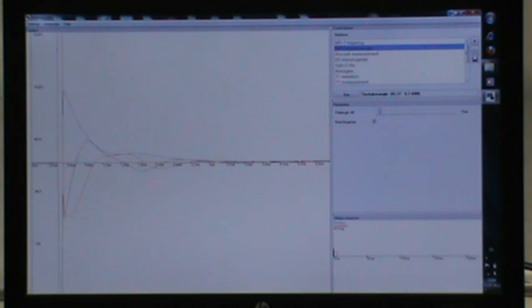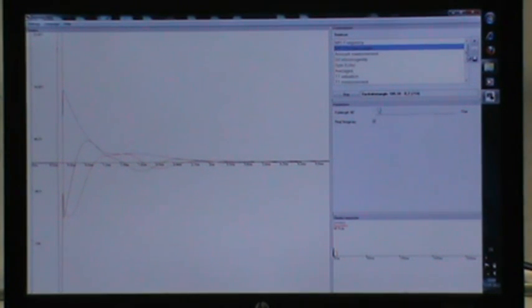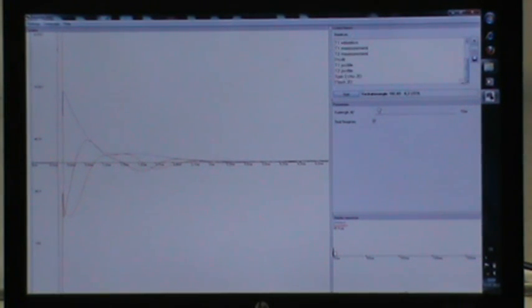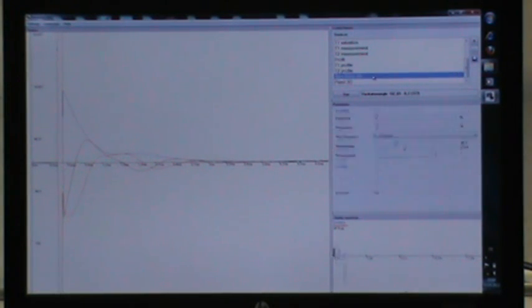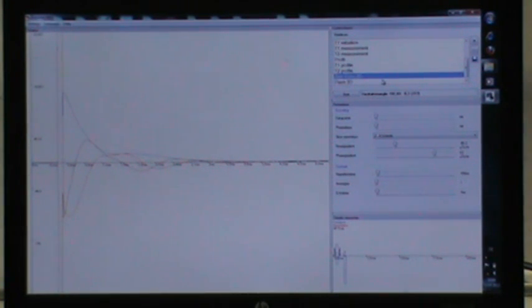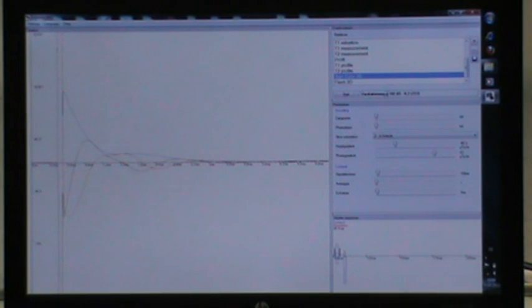Fifth, select the experiment called SPINECO2D from the experiment section. Set the number of data points to, for example, 128 and the number of phase steps to, for example, 64.